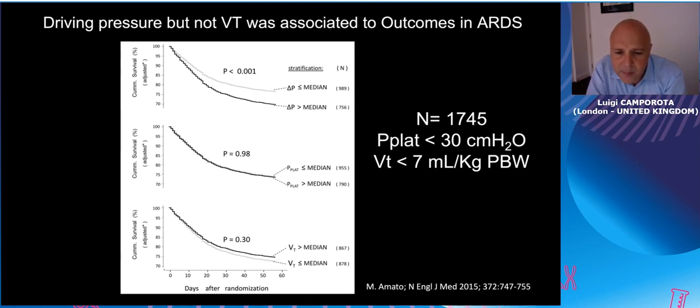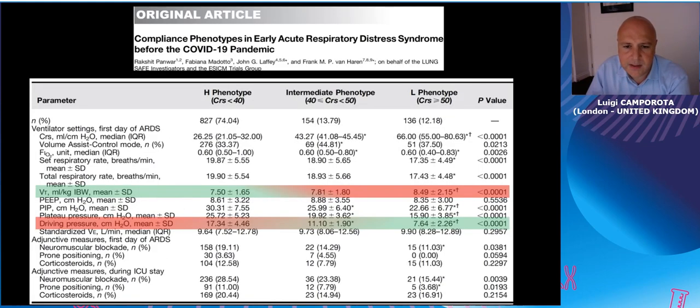In a way, driving pressure is essentially the scaling of the tidal volume to the lung volume, or in other words, the ratio between tidal volume and lung compliance. A high driving pressure indicates that the tidal volume is too big for the level of gas volume of that particular patient. So this is one of the ways that we can scale the tidal volume to individual patients with an individual severity of lung disease.